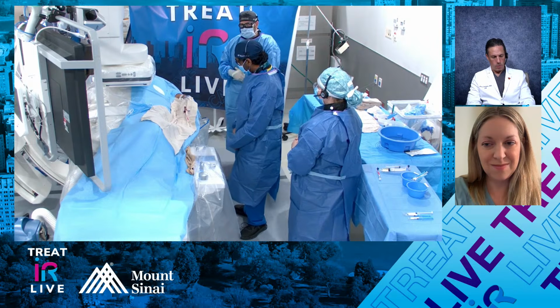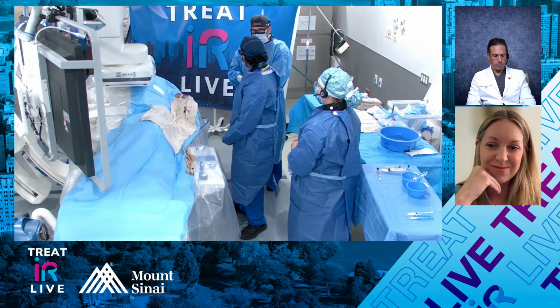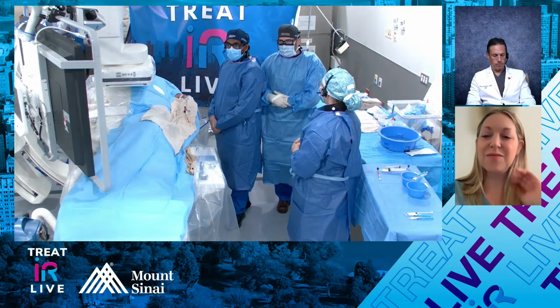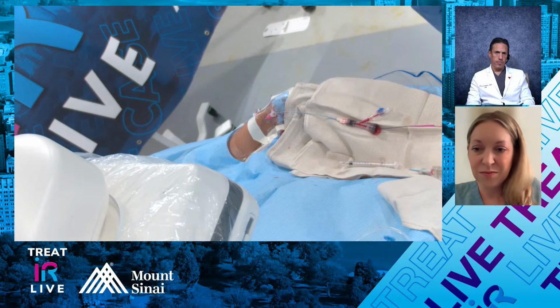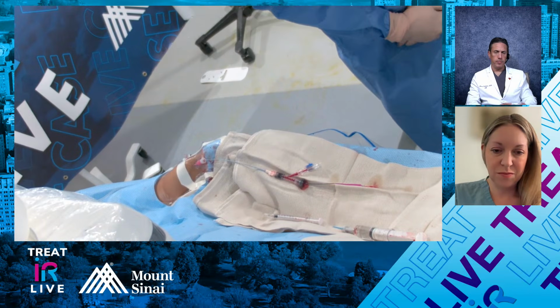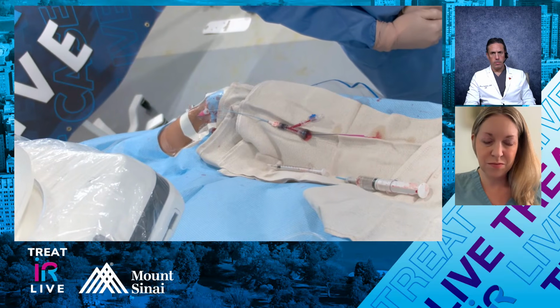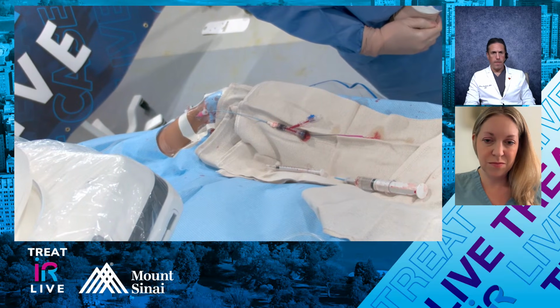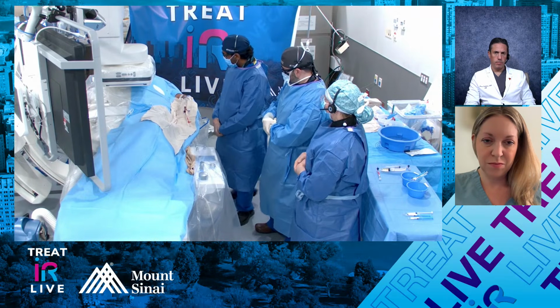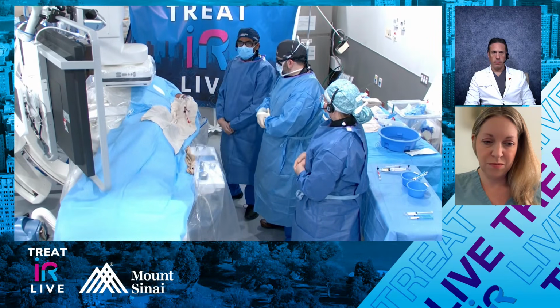Yeah, in honor of the great Aaron Fishman, I went radial. Been doing more and more of these radial. The femoral access is great, and you can really get into the IMA pretty easily, especially with the rim catheter, 65 rim, and go through things pretty quickly. I saw her earlier in office hours, and I went through everything with her. She expressed a preference to go radial if possible. So we scanned her outside in the holding area, and she had an appropriately sized radial.